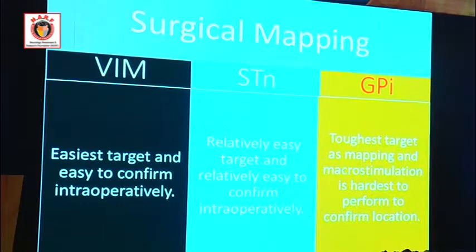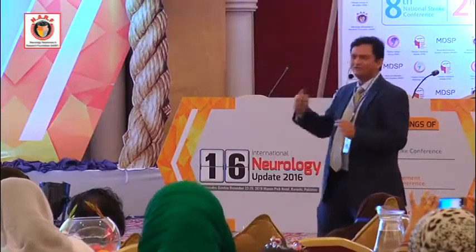Surgical mapping, so it's more practical issues. Doing the surgery is very easy for VIM in our centers, and STN is relatively easier. Intraoperative neurophysiology is easy, intraoperative stimulation is easy, while GPI, very tough target.